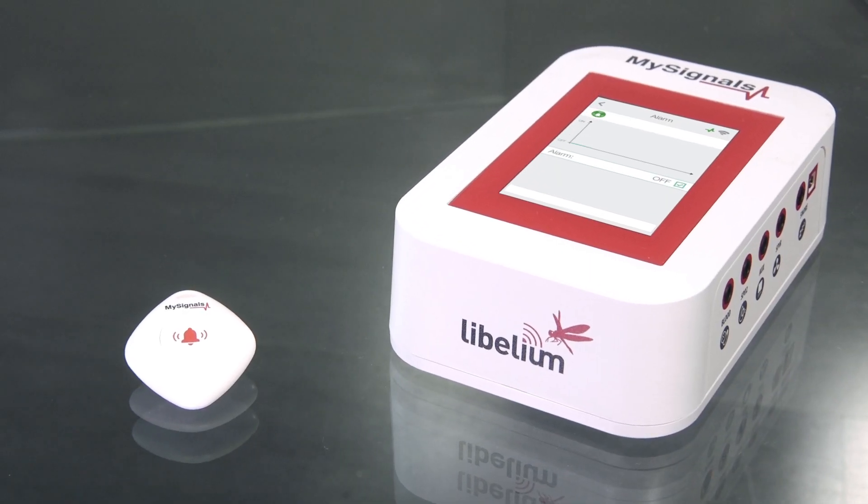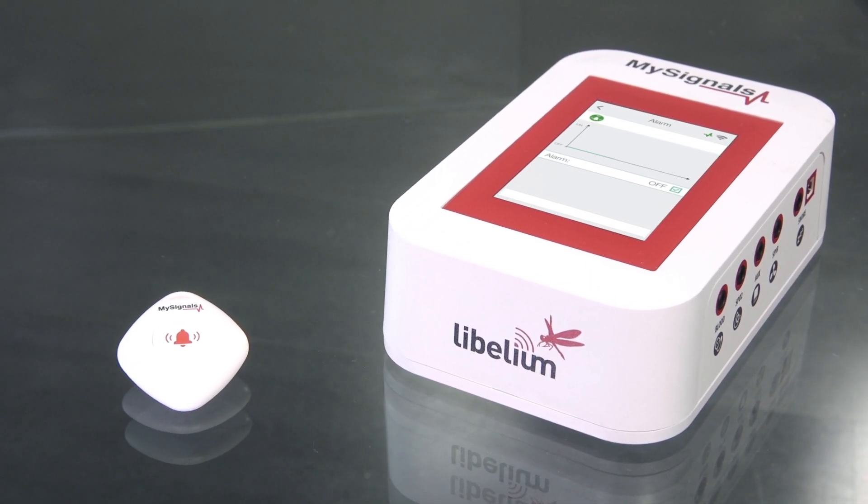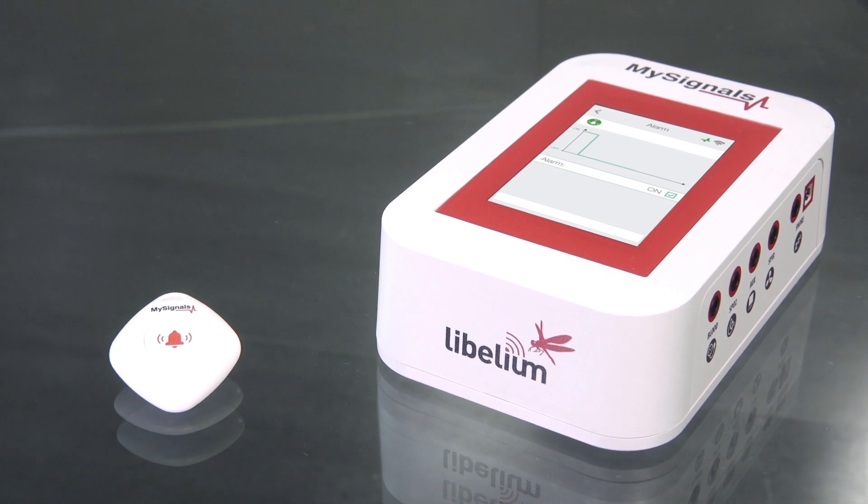Now you can visualize the Alarm Button values in real-time on the MySignals screen using the Standalone mode.